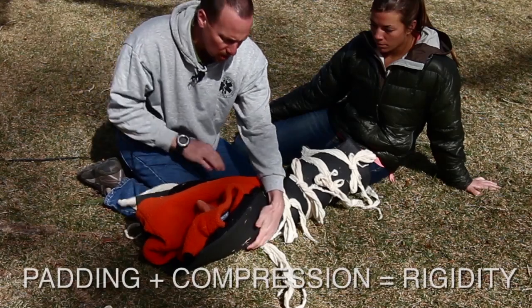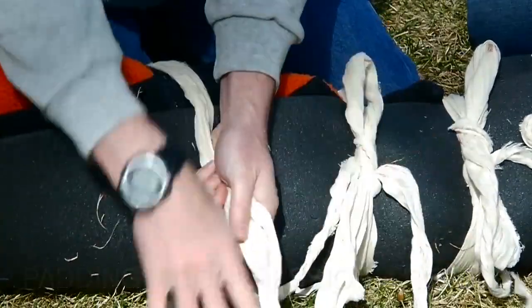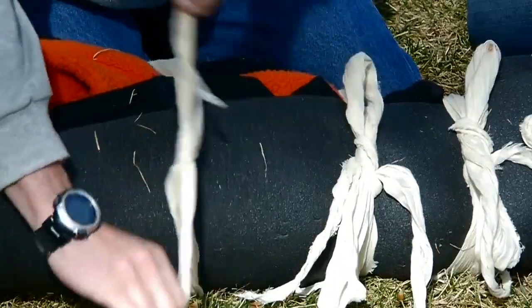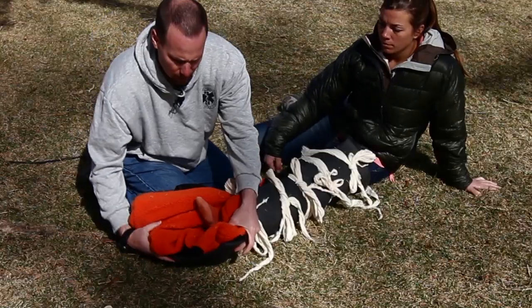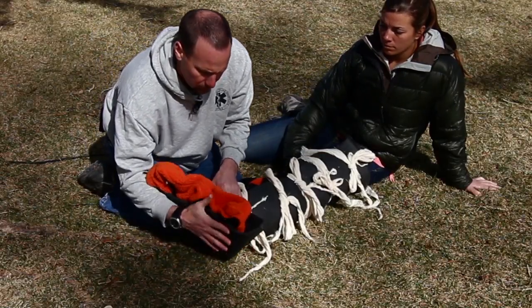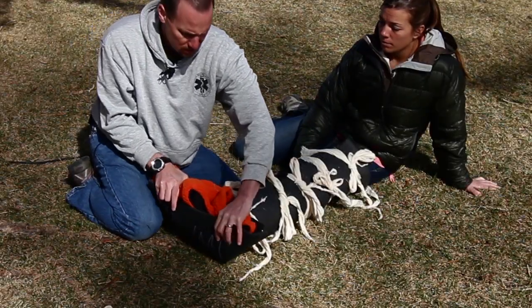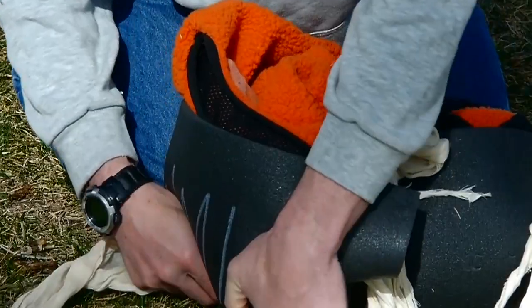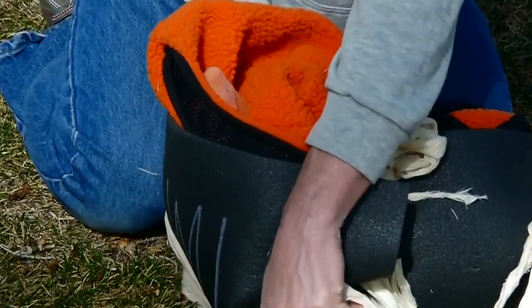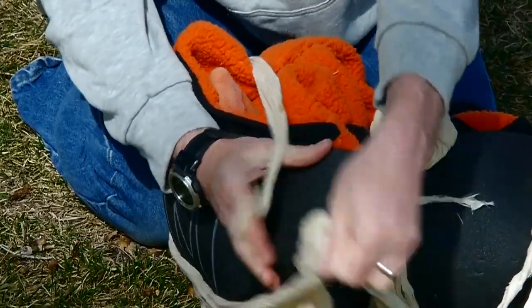I'm going to tie one more tie-off down here right around Jordan's ankle. So far I've done a nice job of immobilizing Jordan's femur. I've set up my padding to extend past the sole of her foot. I'm going to take all this padding and fold it up to create a T-shape. I'm going to take the two wings of my T and fold them towards my patient's knee, and I can take one more tie-off to secure a box wrap that creates some nice foot support.